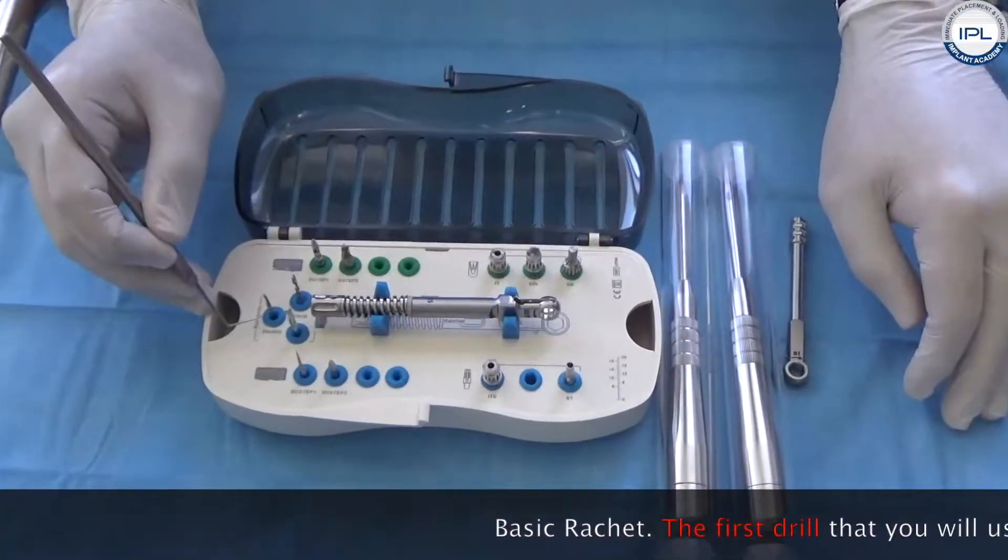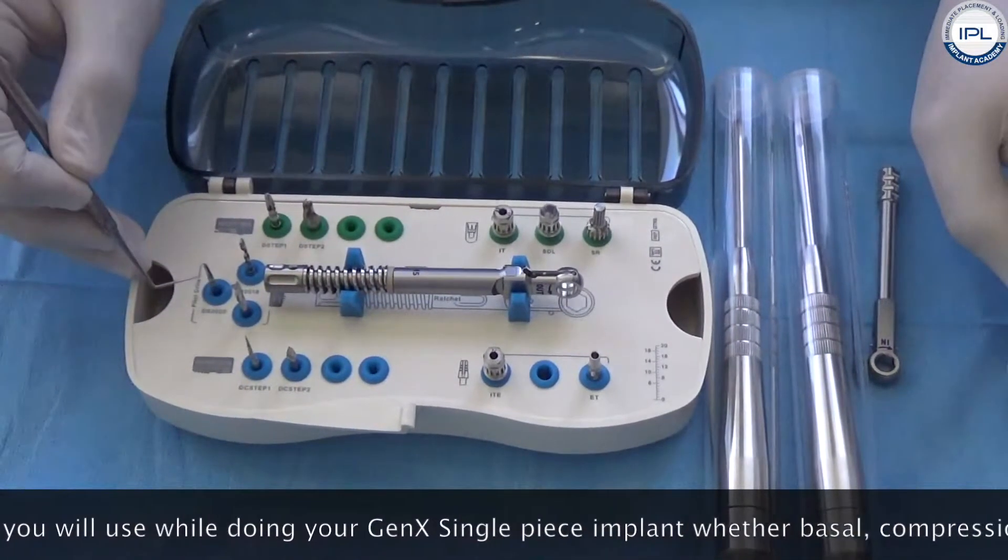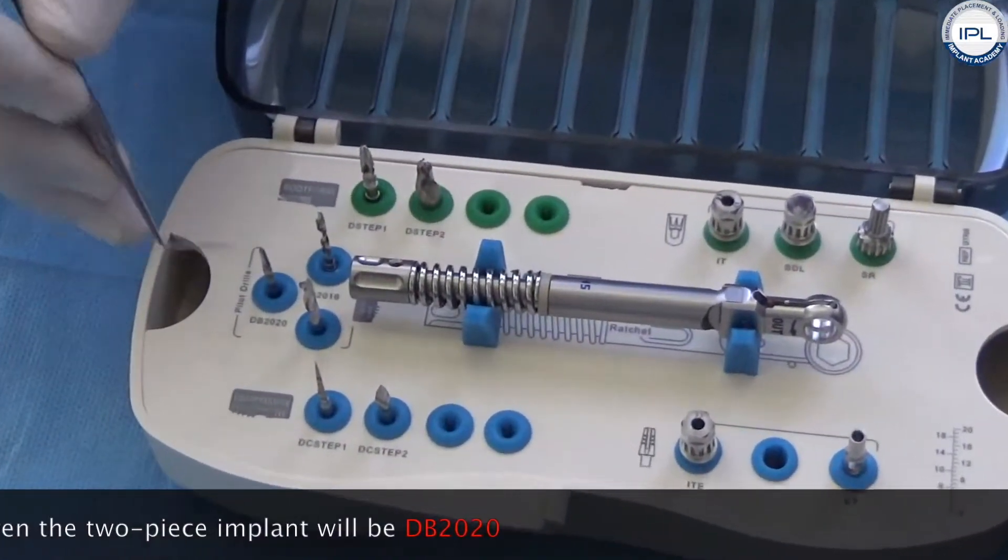This is a basic ratchet. The first drill that you will use while doing your Gen X single-piece implants, whether basal or compressive, even for the two-piece implant, is this drill.